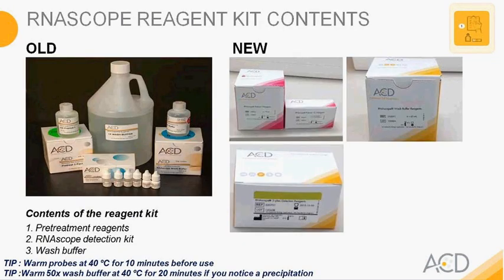The next is the RNAscope reagent kit and contents. Most of you are probably familiar with the old setup for our reagent kit. The main contents of the reagent kit are pretreatment reagents, RNAscope detection kit, and wash buffer. What's not included in the reagent kit are probes. However, this reagent kit and the information that I would like you to understand are all part of this discussion.